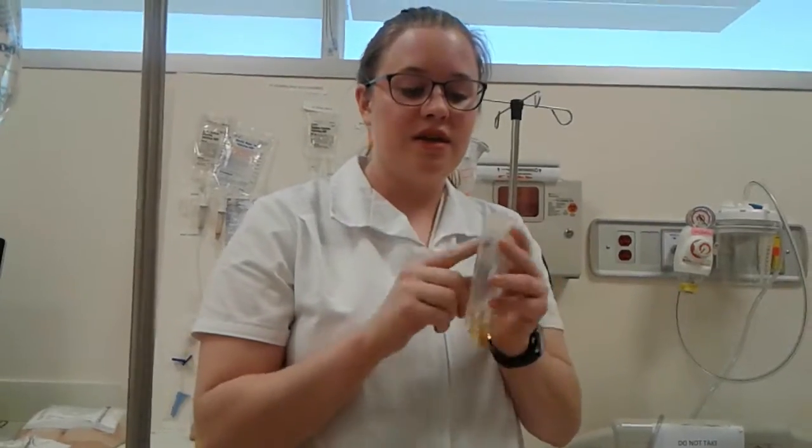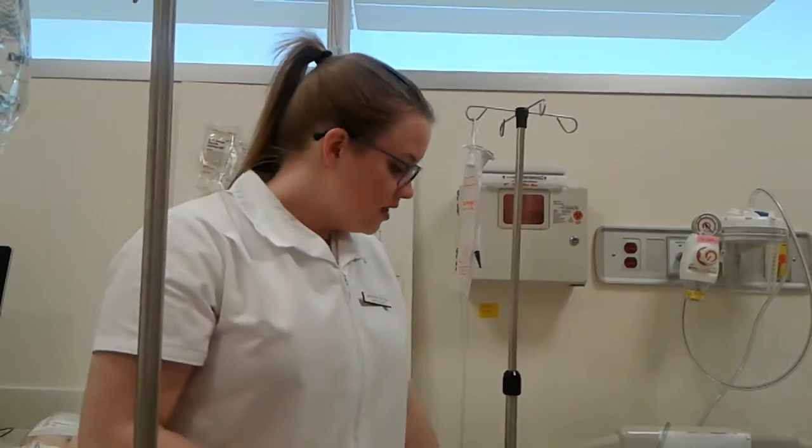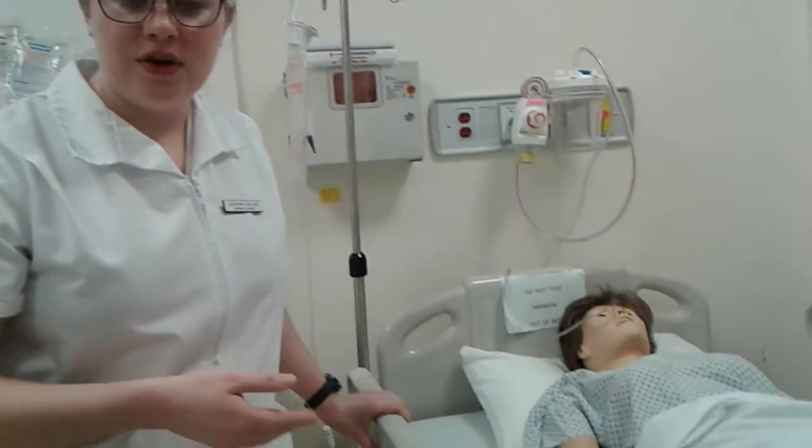I would compare my medication to the physician's orders and the record. I would then obtain my IV piggyback solution, checking the expiration date on the medication and comparing the medication to the MAR. Next, I would need to assess the patient's IV site in their arm.